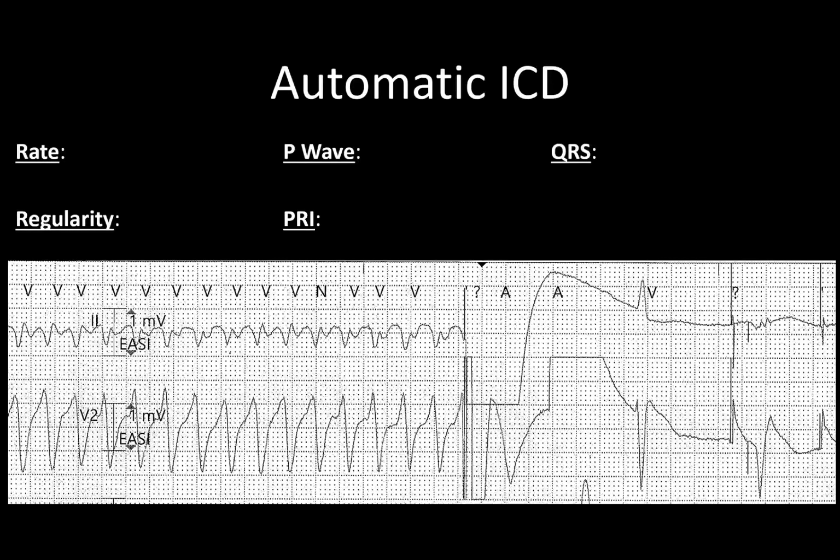I've included this strip just because it's rare to catch one of these, so I think it's just neat for you guys to have seen it. This patient's starting out in VTAC over here. That's what this whole mess is. But then right here is where you see the defibrillator go off. And that's what all this is, that really sharp spike in the electricity followed by some recovery time, and then the patient goes back into their normal rhythm, which in this case is being paced, but that's what it looks like on the screen when a defibrillator goes off.